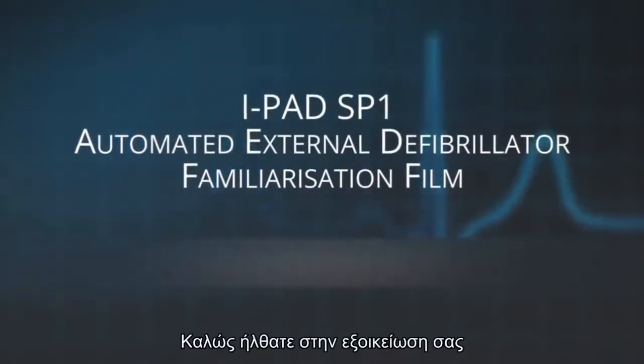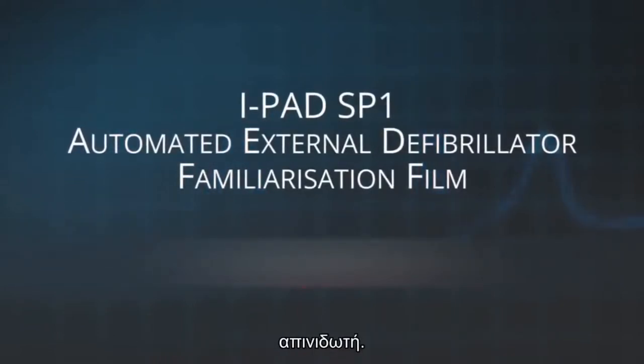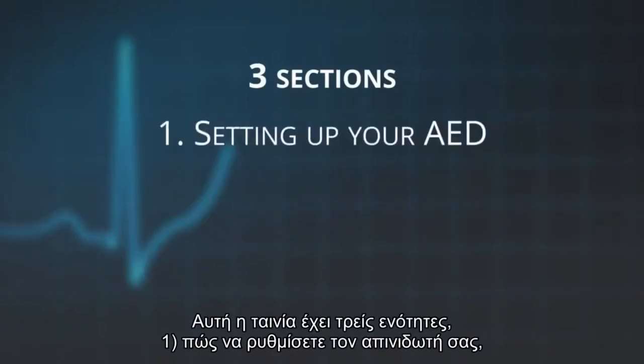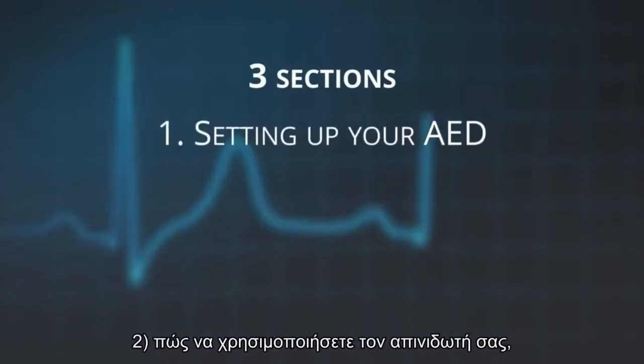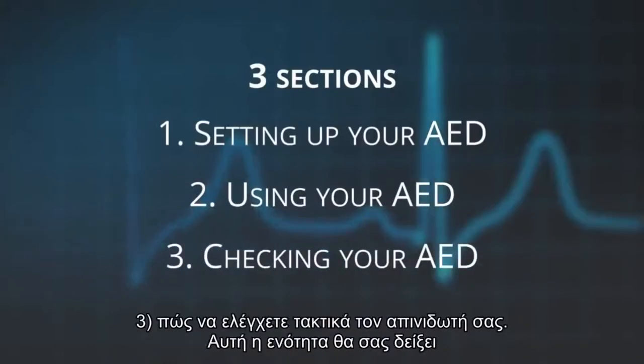Welcome to the familiarisation of your iPad SP1 automated external defibrillator. This film will go through three sections: one, how to set up your AED; two, how to use your AED; three, how to regularly check your AED.